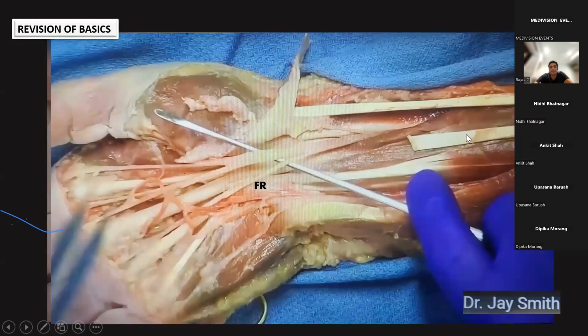If we remove the palmaris longus tendon, then we can see this is the median nerve. It's coming out from the undersurface of the flexor digitorum superficialis on the radial side and passing through the carpal tunnel and giving branches to the digits. But if you notice very carefully, you can see another very small branch arising on the radial aspect. And this is the palmar cutaneous nerve.